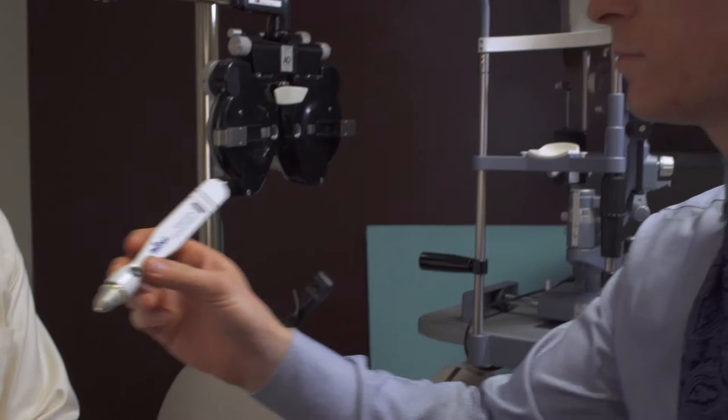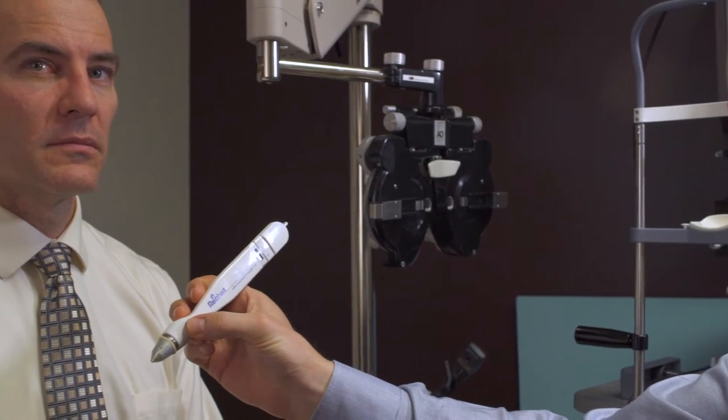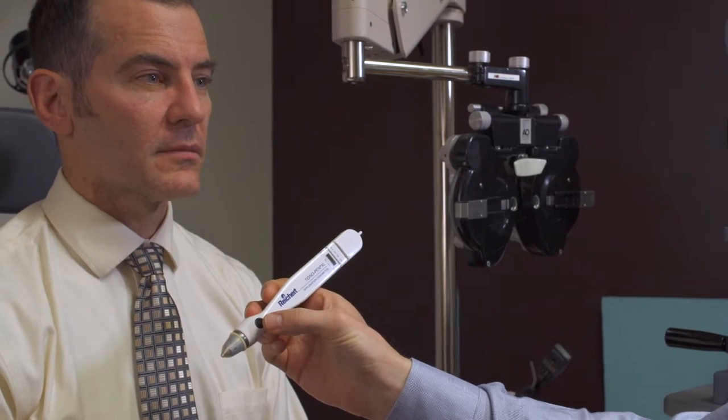For the Tonopen, on this particular model there are two dashed lines that you'll see when it's ready. You can assess that by clicking the button and it should come up.